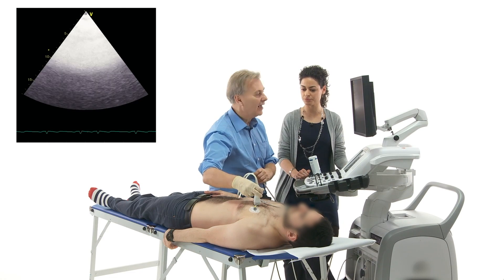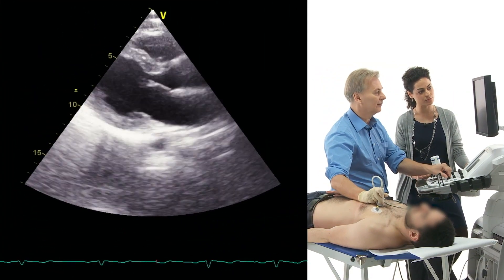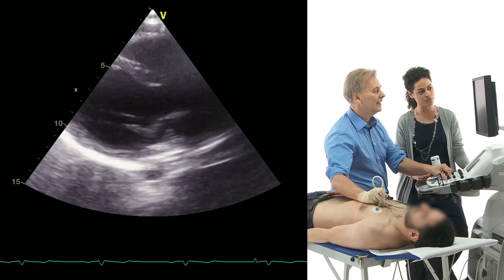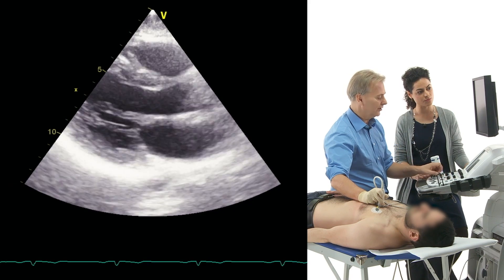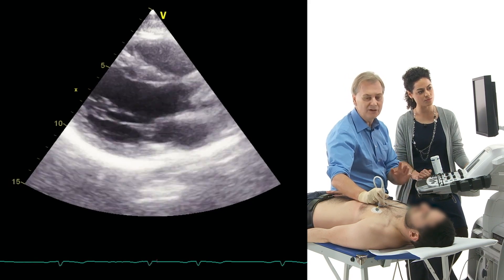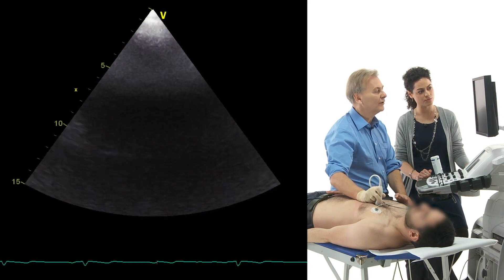This is the parasternal long axis view and image quality is actually terrific in him. Of course in many patients you will not get such good image quality. A little trick you can use is first of all try to stay as close as possible to the sternum, and second move the transducer down to an intercostal space.